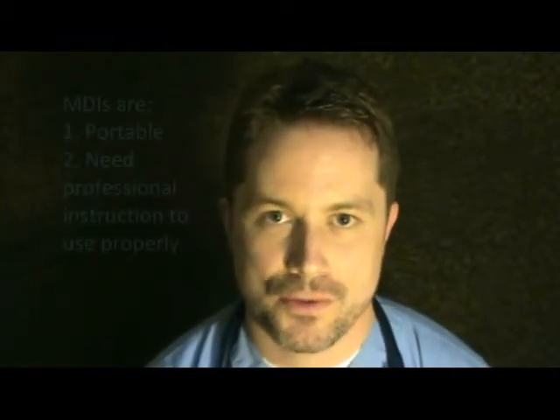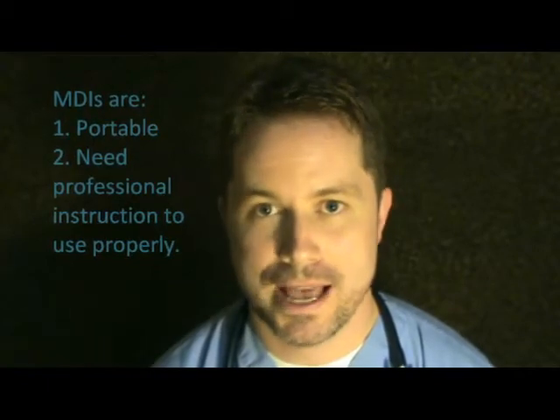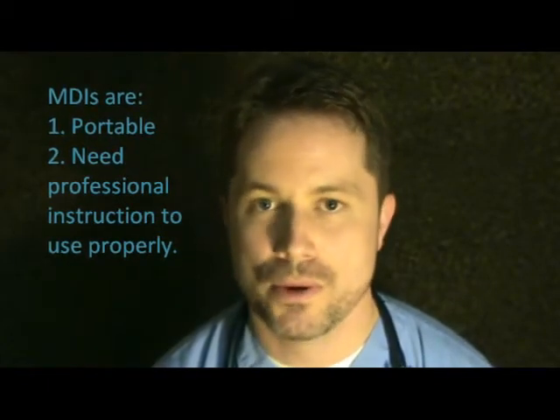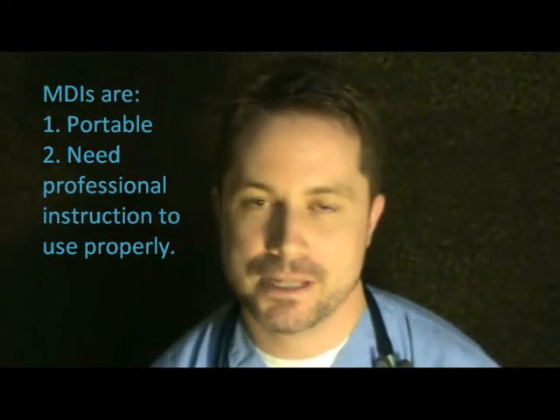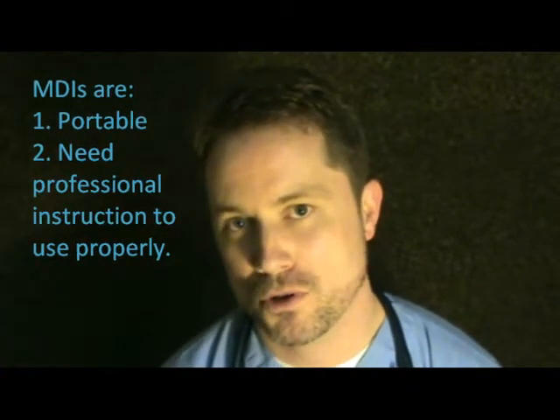Today I'm here to teach you to use an MDI, or a metered dose inhaler, properly. In order to manage your asthma well, you need to know how to take your medication properly. Nebulizers are not very portable, but they don't require a whole lot of skill to use correctly. An MDI, on the other hand, is very portable, meaning you can always carry it with you. If you ever find yourself in the midst of an attack, you're always going to have your MDI to help pull you through that much quicker.